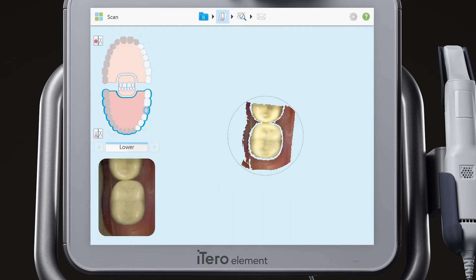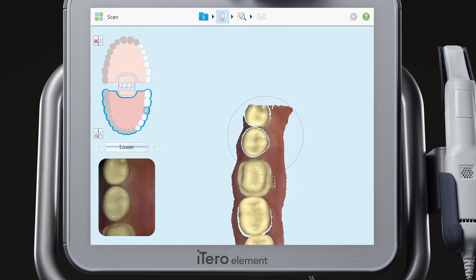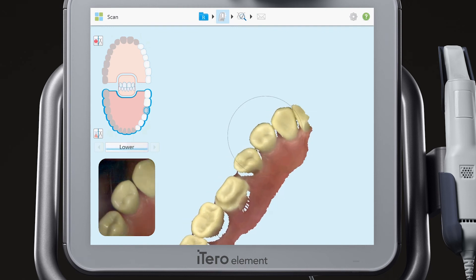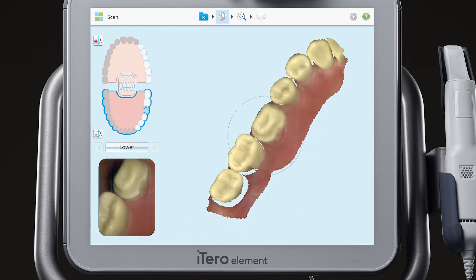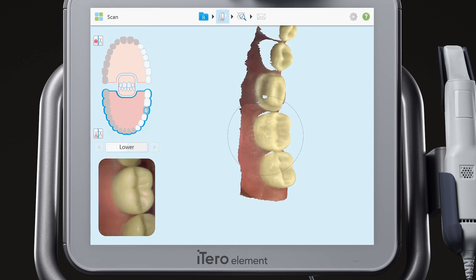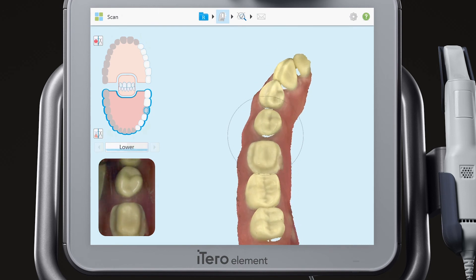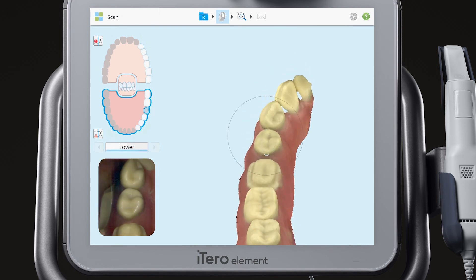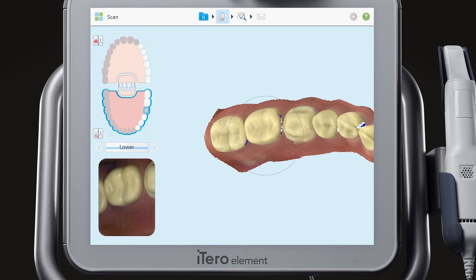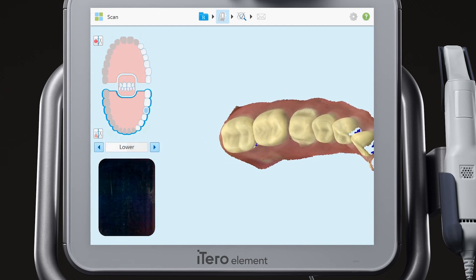Next, scan the occlusal, lingual, and buccal of the prepped arch. Use the arrow to move to the bite segment.